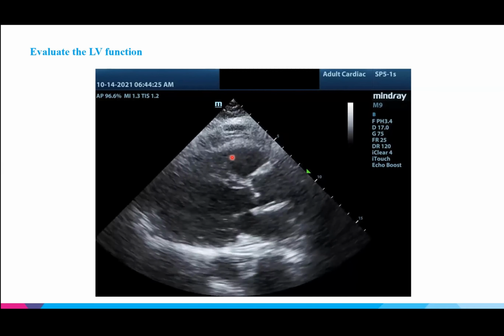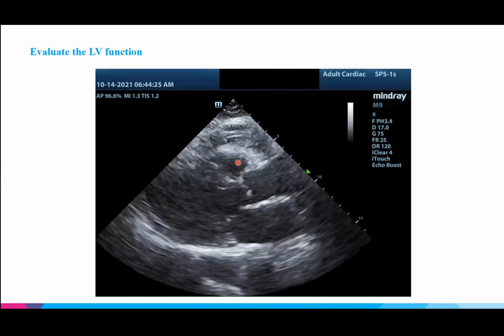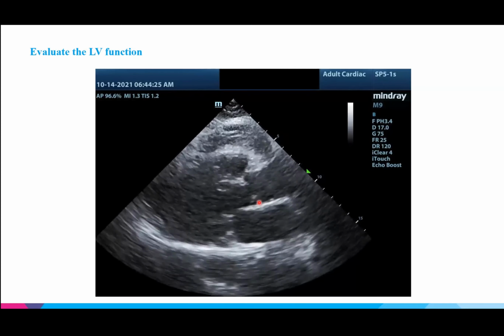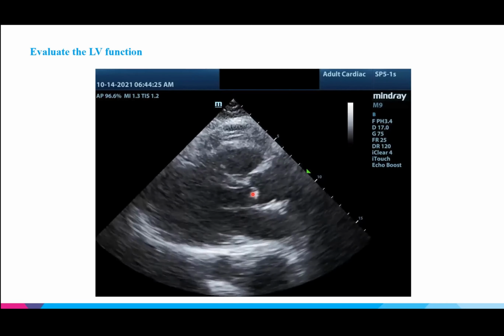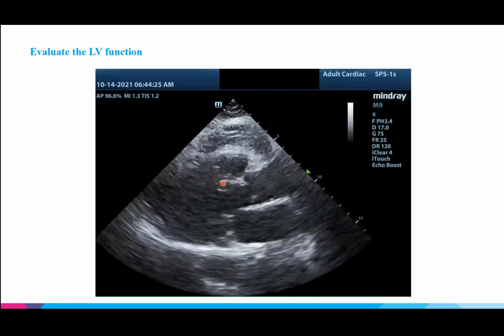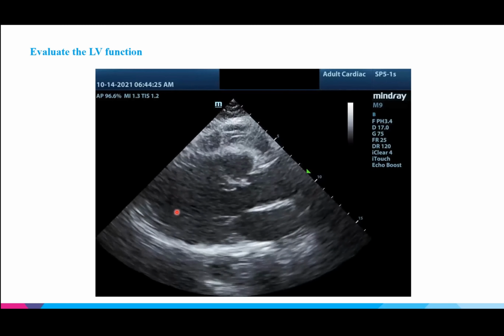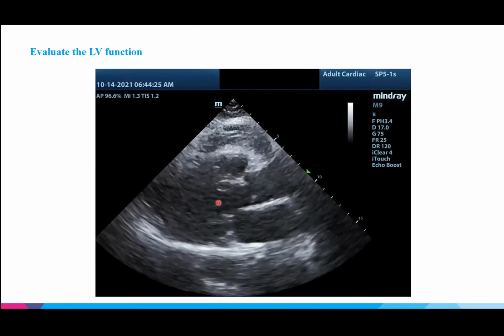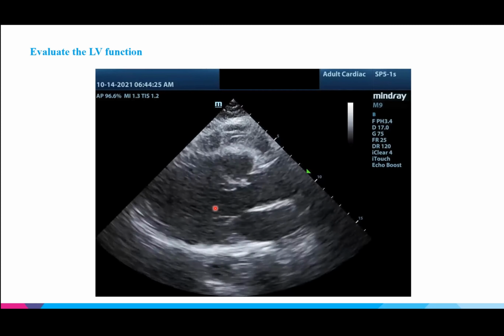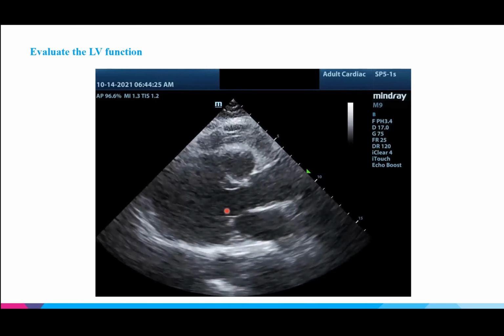Yeah, parasternal long axis. And so what's up here? Yeah, RVOT, right? And then you have your aortic valve here, your mitral valve, and the interventricular septal wall is probably here. We're not really seeing the other aspects of the left ventricle or even cavity size, really, maybe a little bit of movement here. So really the main thing that I have to go on with this view, if I had to assess LV function, was the anterior leaflet, right?